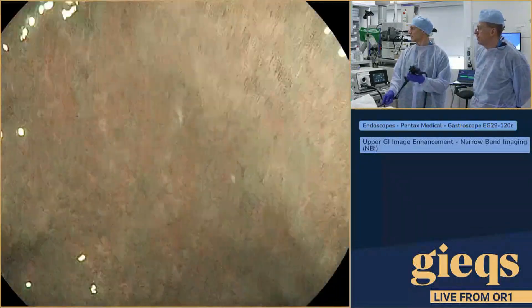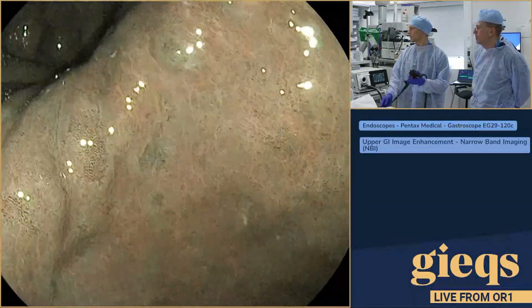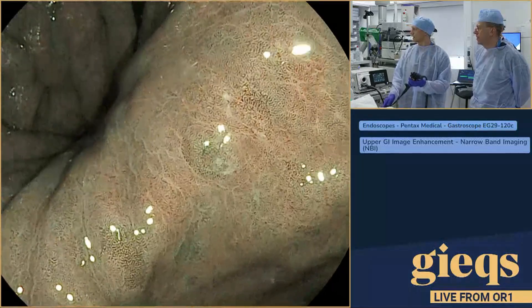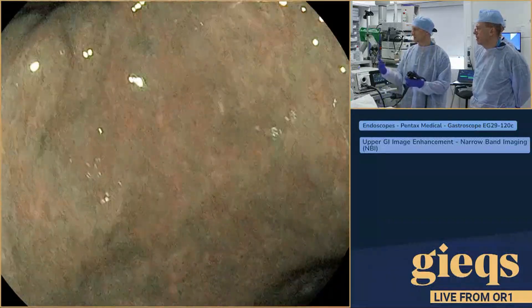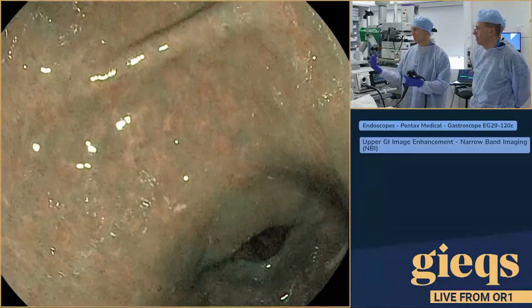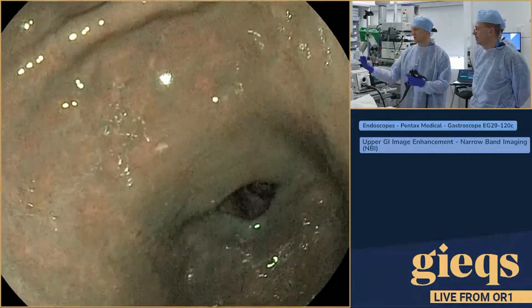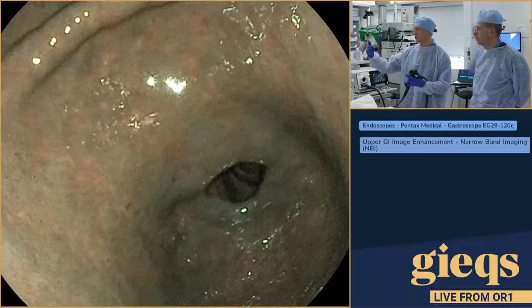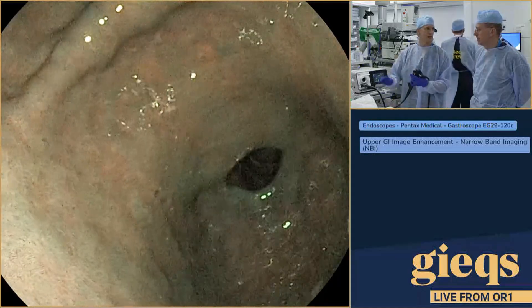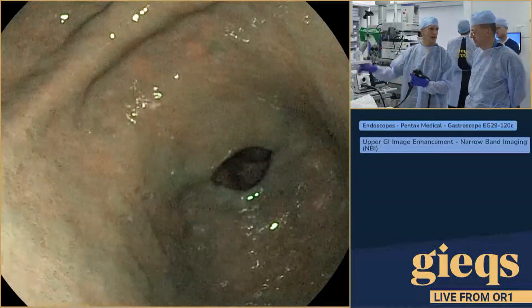So have we seen enough, or do we need to look a little bit more carefully? To finish off, I changed from white light to enhanced imaging and go over exactly the same stations.